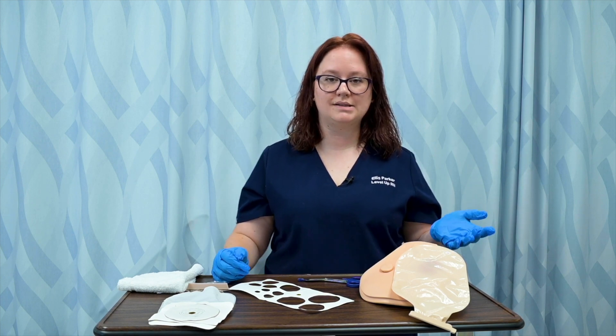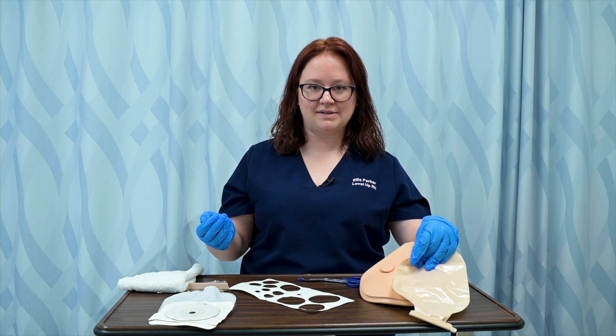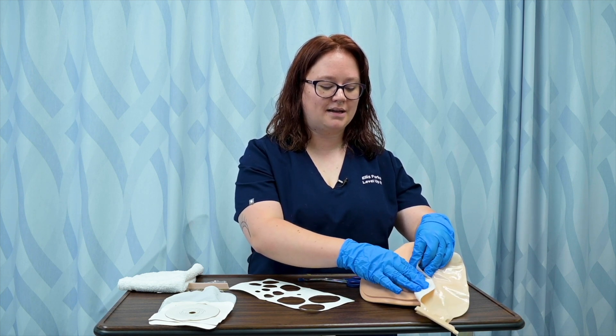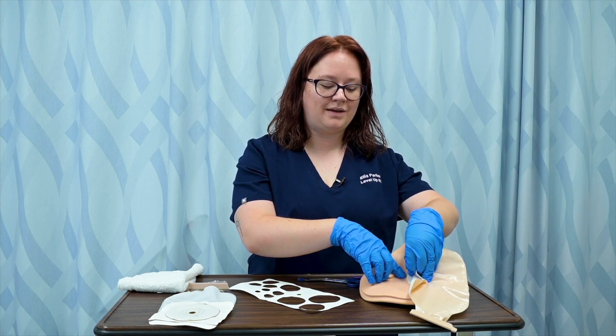So the first step is to remove the old ostomy. Regardless of the type of system, whether it's a two piece or a one piece, the wafer is adhered to the skin. So I'm going to want to move my bag and I'm going to want to push down on the skin and gently lift the wafer.